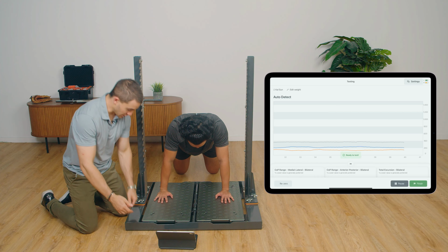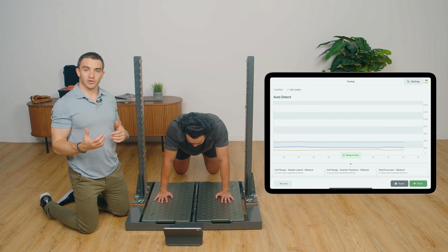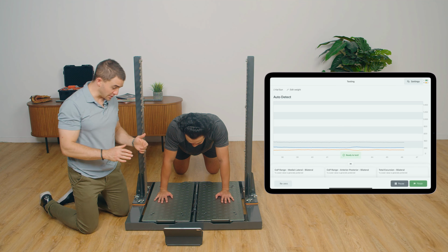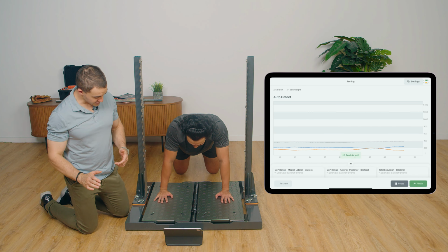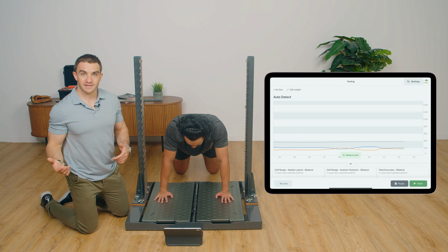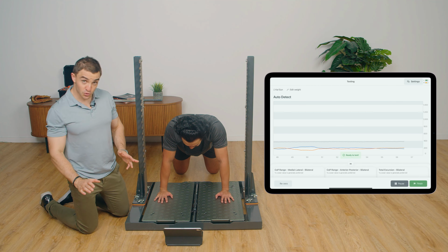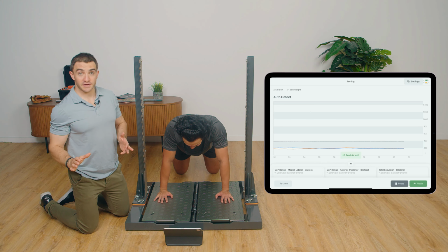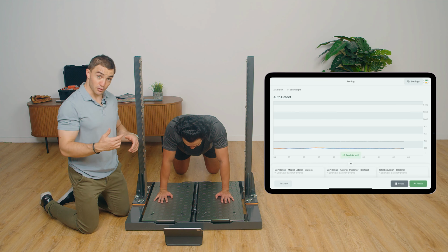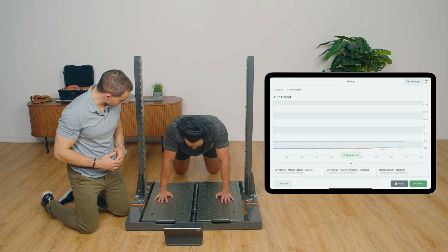So what I'll do is I'll just pop the trace in front so Cal can see it, and I'll give him a gentle cue or a little bit of a constraint, saying, you know, Cal, what I want you to do, gently shift side to side. I want you to push over to the right side, maybe until you feel 3 out of 10 pain, or, once we progress a little bit further, try and put as much weight on that right side as possible. So the patient can get an understanding of how much weight they can shift side to side, and it's good to progress. Again, once we're happy in the kneeling position, go ahead and go into a full push-up position, Cal.